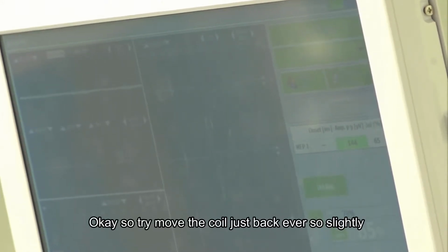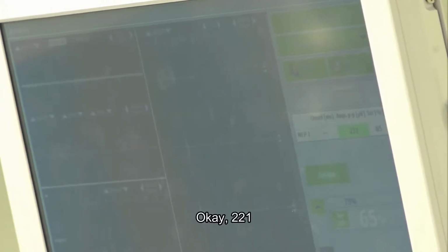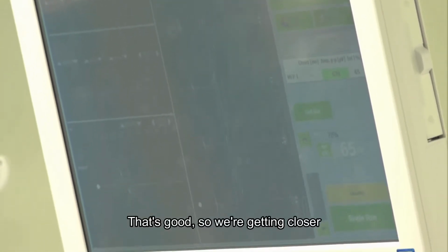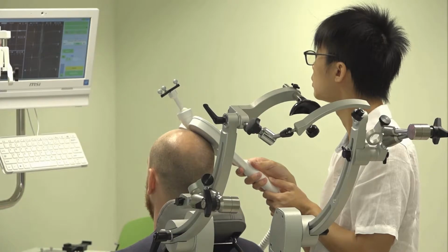Okay, so try and move the coil just back ever so slightly. That's it. Okay, 2, 2, 1. Yep. Okay, so that was in my little finger there. So keep going. That's good. So we're getting closer. Excellent. Oh, big response there. Okay. Another good one there.